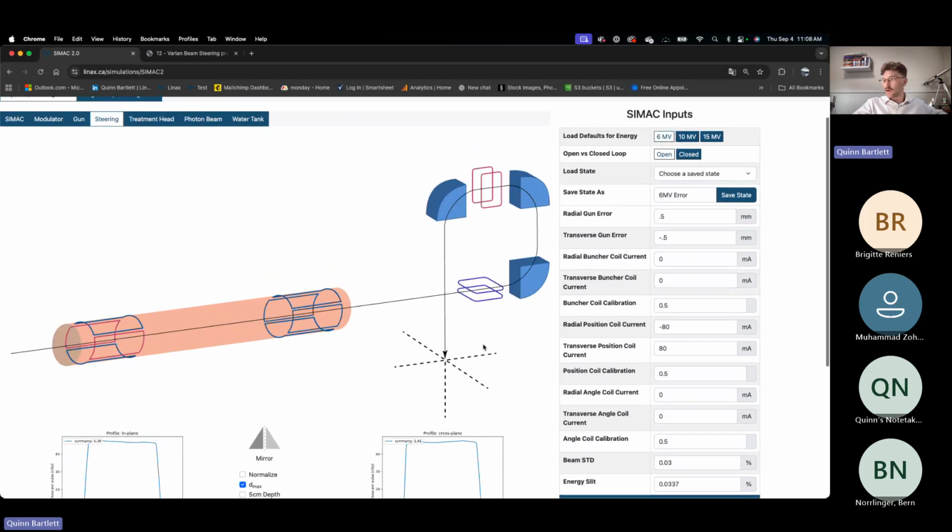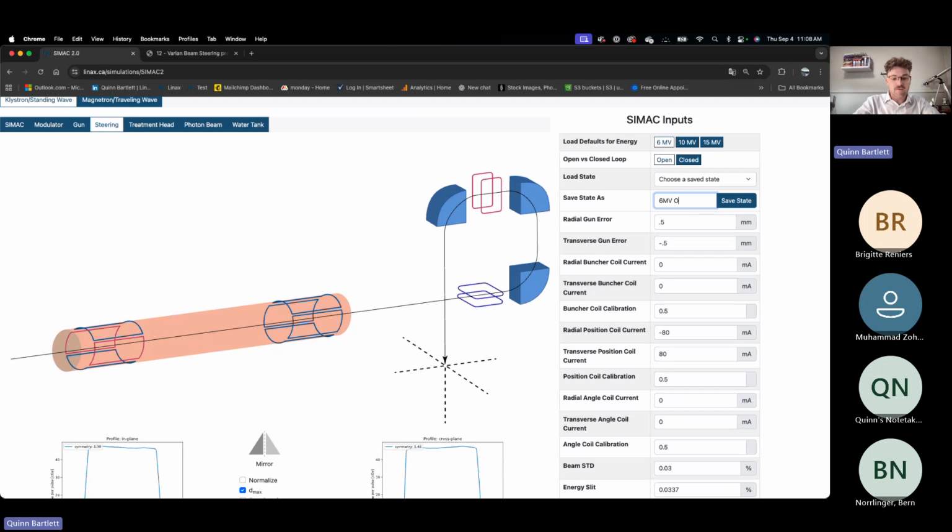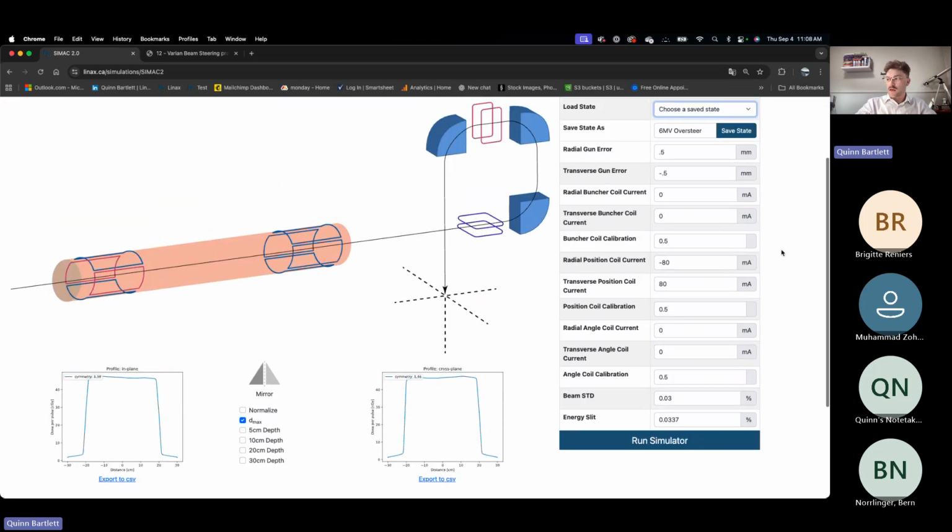And so this is good. We can call this now our 6MV oversteer, and that's great. And so we can save that. Then in our load state, we can confirm that oversteer is still there. And then we can do some more fine adjustments. Obviously I have the golden numbers in front of me of how to get us back. But this is where you really have to play around and go back and forth between values to find out which current is going to get you back to your highest form of symmetry.